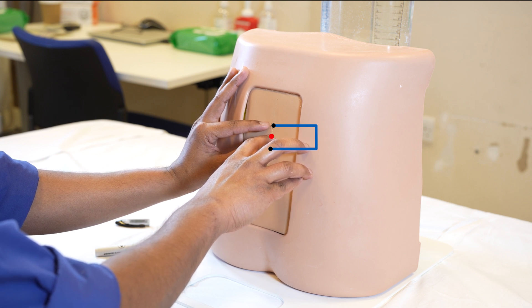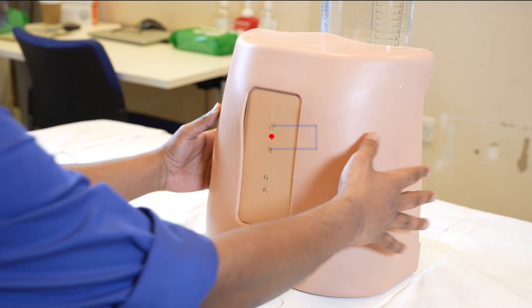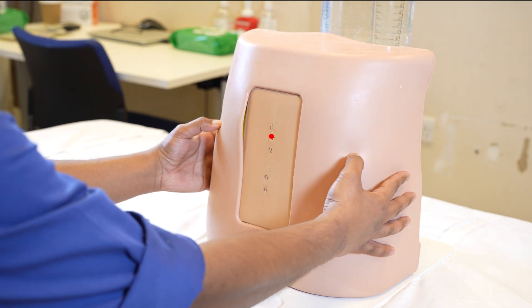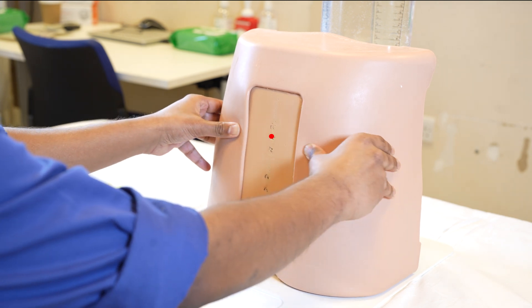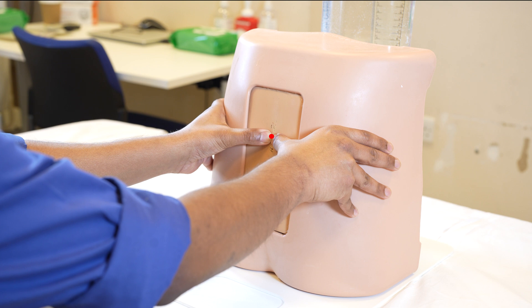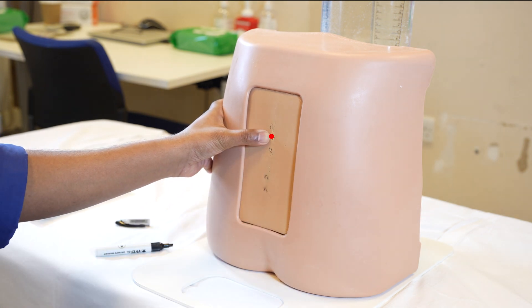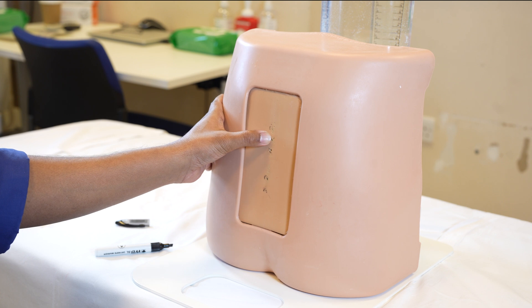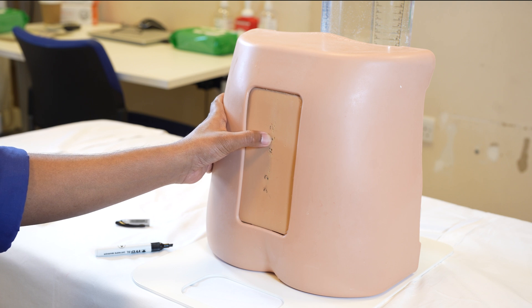You want to confirm further that this is indeed the L3-L4 region, and you can go back to the conventional technique — palpate the iliac crest, extend your thumb, and extrapolate your thumb back to the midline. And it has matched what you just found on ultrasound. So this is your L3-L4. We know roughly where it is, but we want to know exactly the point to insert our needle, which we will find using the midline or paramedian technique.